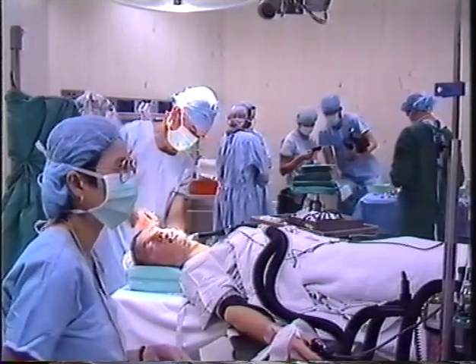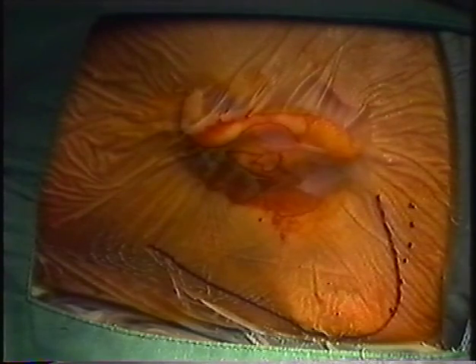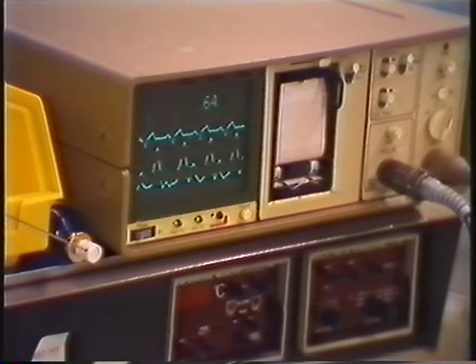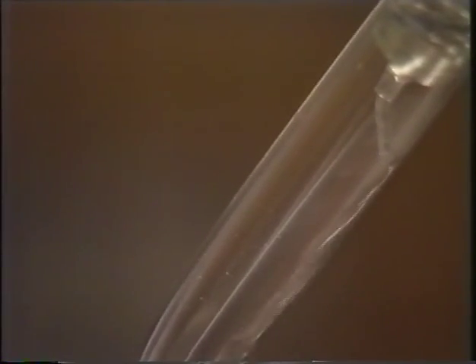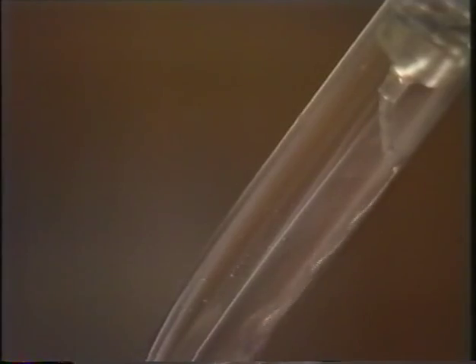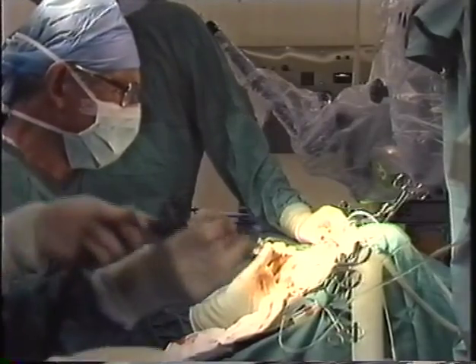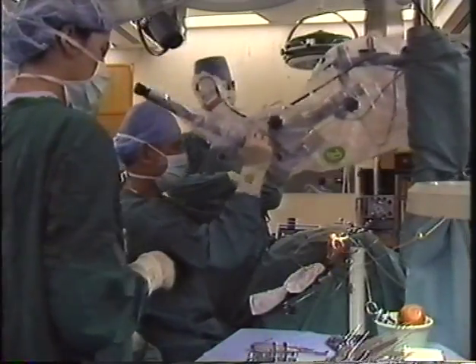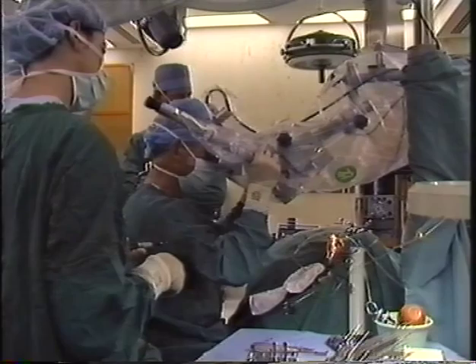These are the operating rooms of the Royal Prince Alfred Hospital, and David is being prepared for his operation. The site of the skin incision behind the ear has been marked, and the surgery can begin. The operation can take as long as 3 to 4 hours, so careful anaesthesia and monitoring is necessary. The skull behind the ear is drilled to allow the insertion of the cochlear implant. First, the opening is made through the mastoid bone. Next, the microscope has to be brought in to do the delicate work of opening up the inner part of the ear.